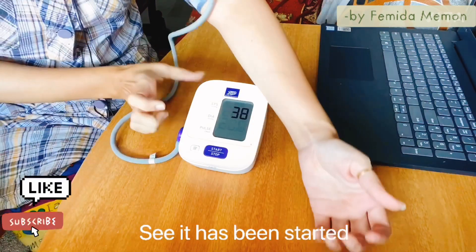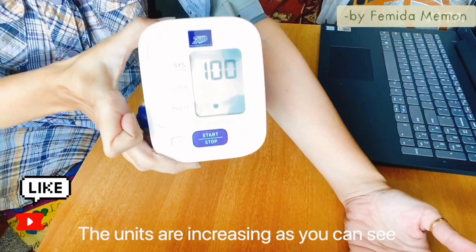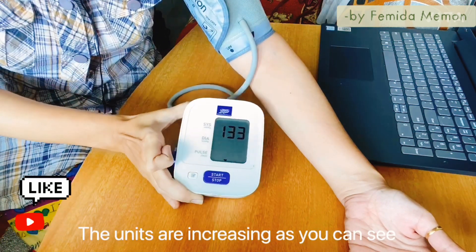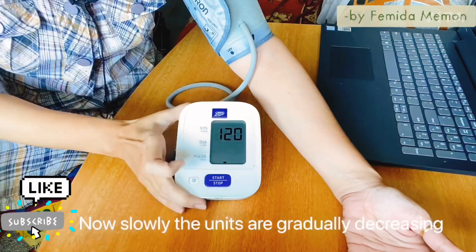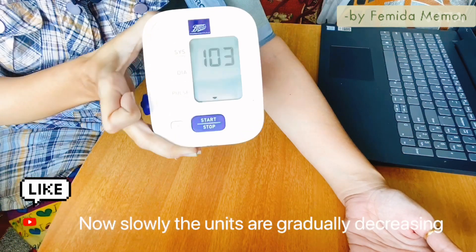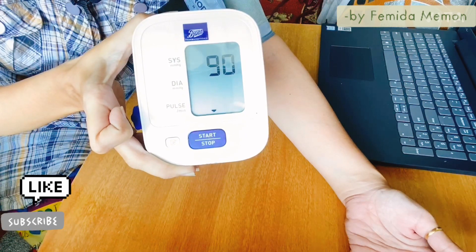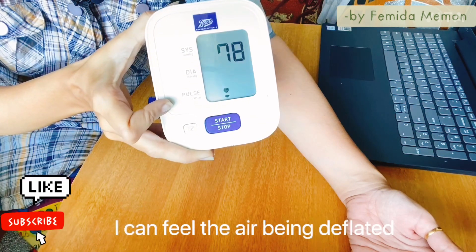The units are increasing as you can see on the screen. I can feel my arm inflating a little bit — the air is being inflated. Now they are decreasing — the units are decreasing and the air is deflating. Avoid talking during measurement, but as I am making this video I have to speak. I can feel the air being deflated and the units are decreasing.